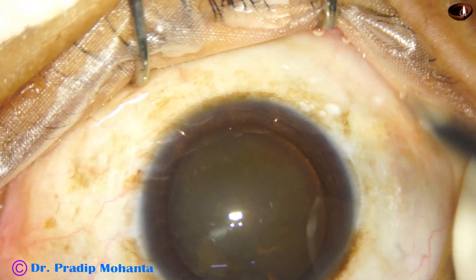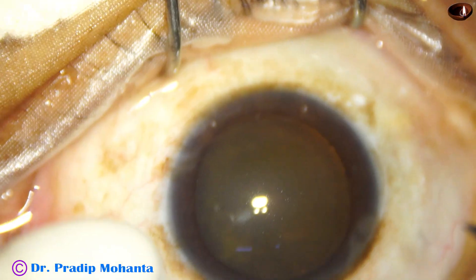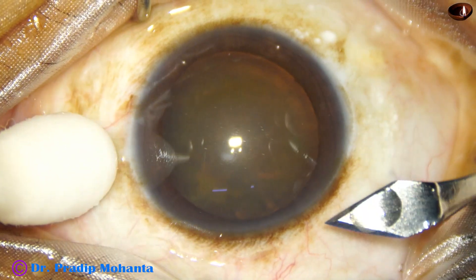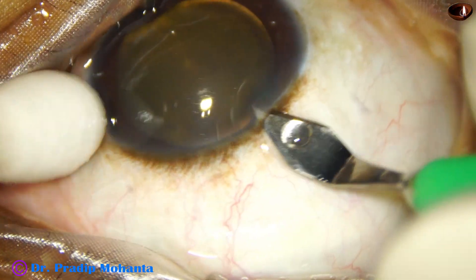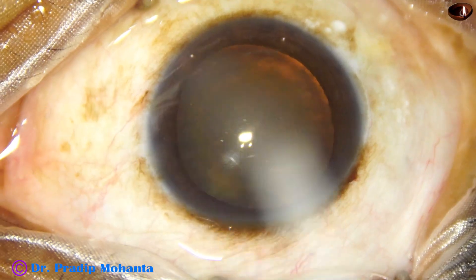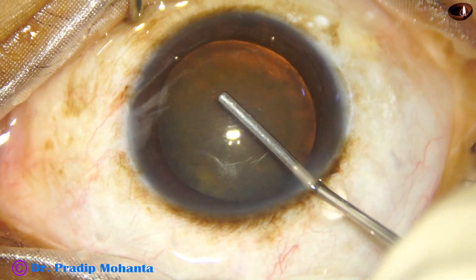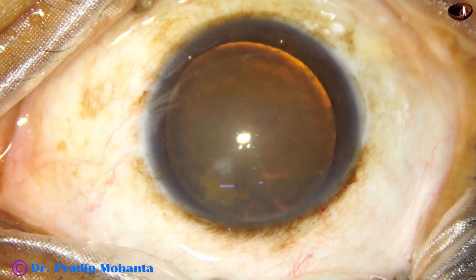This is a cataract in a vitrectomized eye. Vitrectomy was done about five years back. Silicon oil was injected in the vitreous cavity. The silicon oil has been removed. Now the patient has come with this cataract. This is a hard brown cataract, and it's a very leathery type of cataract. Let us watch this surgery.